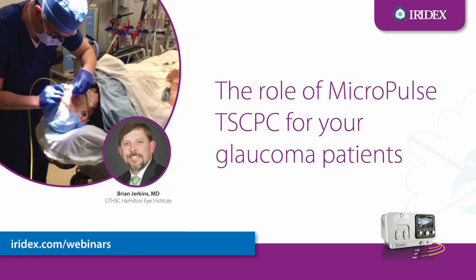And then it does tend to be consistently steady, and maybe even a little bit more drop over the next couple months. But that first 1 to 2 weeks is kind of the big first drop to me. Very good.